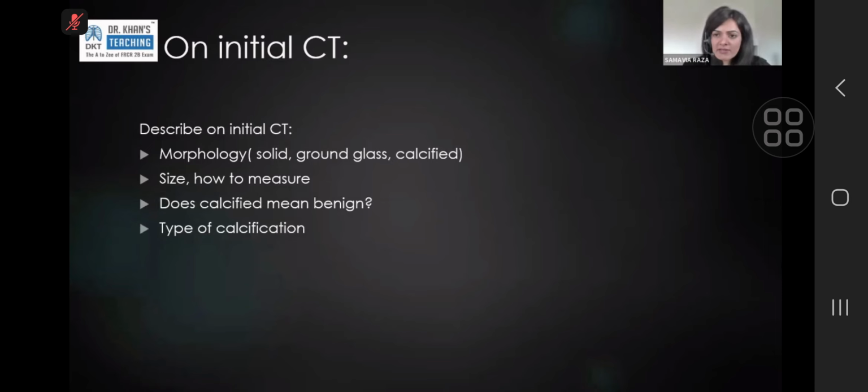You would need to describe that calcification. So fleck calcification, popcorn calcification have different differentials. So rather than use textbook terms, use your own terms. It gives you more leeway. It keeps your brain working, because sometimes we say a specific term and we get put down a certain path in a viva and it's hard to get out of it.